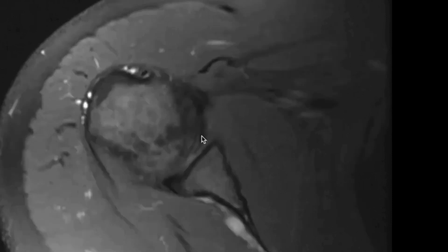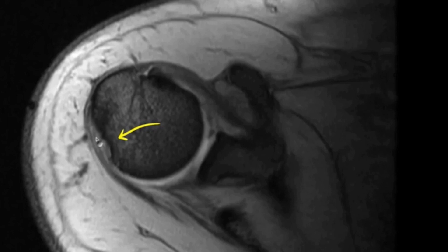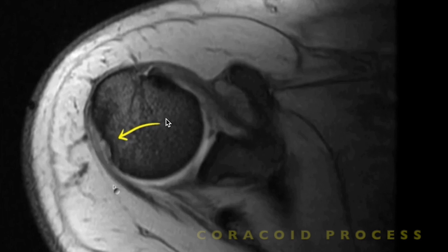This is a 35-year-old male patient with history of repeated shoulder dislocations. MRI proton density fat suppression image demonstrates normal posterior inferior glenoid labrum and deficient anterior inferior glenoid labrum — this forms the Bankart lesion. The MERGE sequence shows the defect in the anterior inferior glenoid labrum very clearly, and there is a trough-like defect in the posterior superior humeral head suggestive of a Hill-Sachs lesion. Hill-Sachs lesion should be looked at the level of the coracoid process, because at a lower level an anatomical notch on the head of the humerus may simulate a Hill-Sachs lesion.